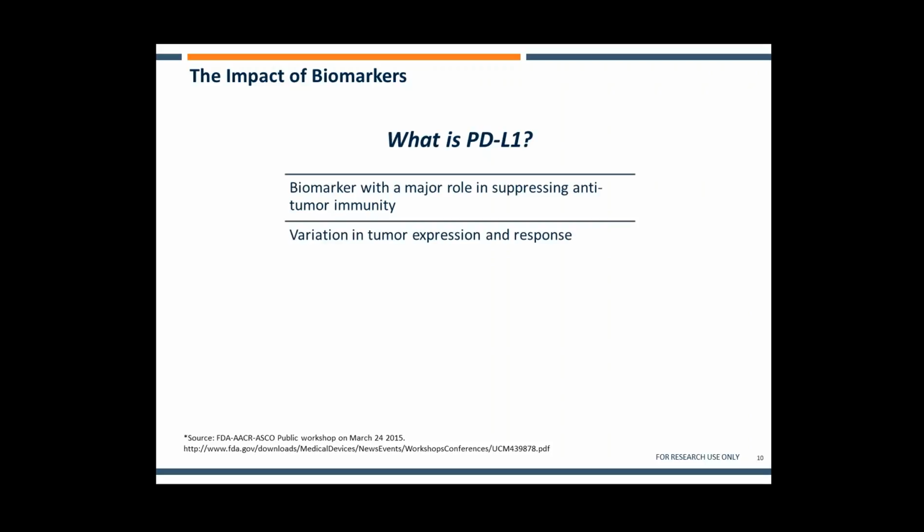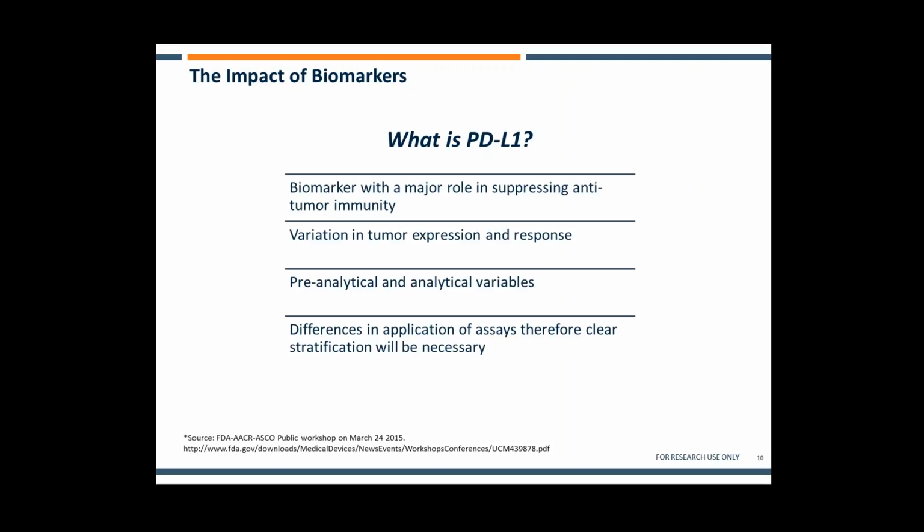It shows variation in tumor expression and response. It's subject to a range of pre-analytical and analytical variables, and shows differences in application of assays. Therefore, it will become more and more important to define stratification for patients. Several open questions still remain on the utility of PD-L1 as a predictive marker, especially in comparison to other biomarkers.